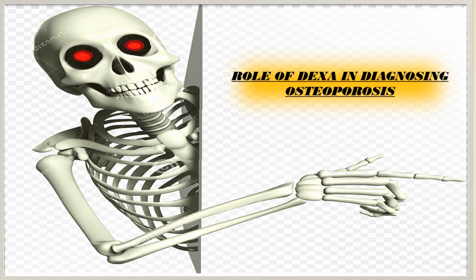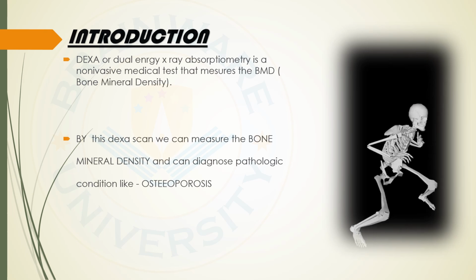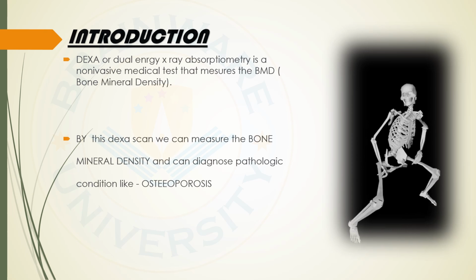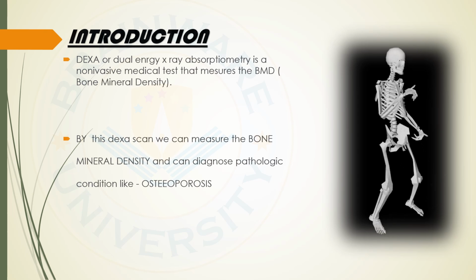I will talk today about the role of DEXA in diagnosing osteoporosis. So, what is DEXA? DEXA full form is Dual Energy X-ray Absorptiometry. This is a non-invasive medical test that measures the BMD, which is bone mineral density. And by this DEXA scan, we can measure the bone mineral density and can diagnose pathologic conditions like osteoporosis.